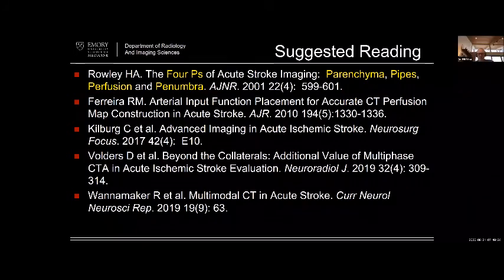There was another question. An anonymous attendee asked, sometimes hemorrhagic transformation can look like luxury reperfusion. Can you give some tips to differentiate?